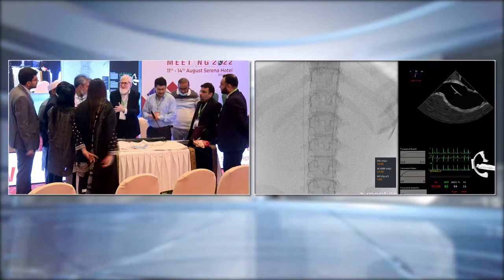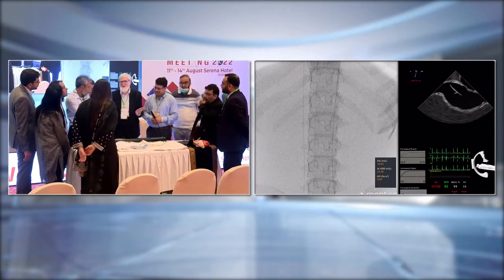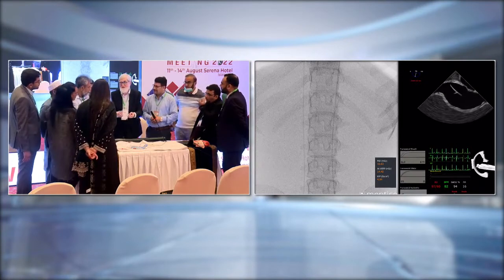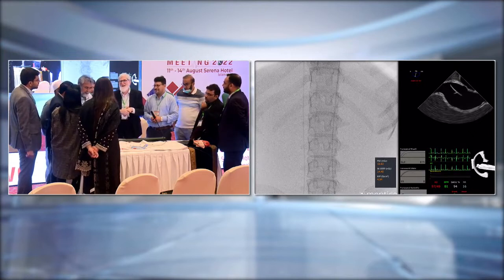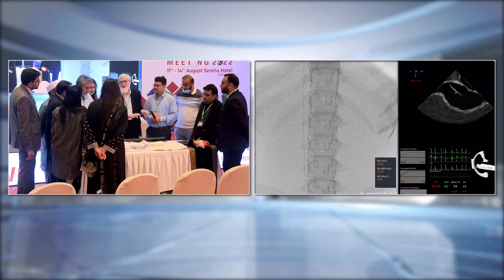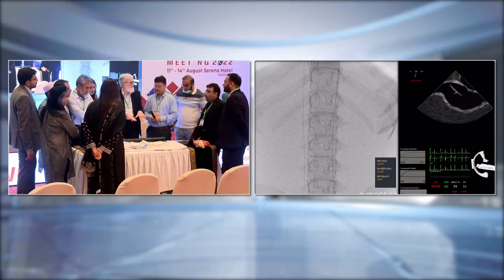Like yesterday night, we were missing one step. That was just flushing. Flushing is virtual here. So if we were not flushing, the thing was not going. So this makes you go according to a system.